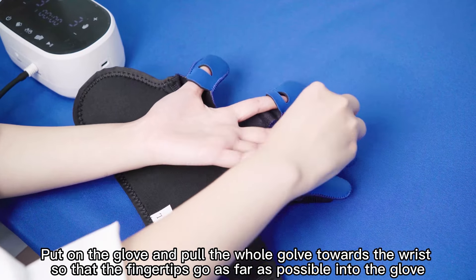To perform mirror training, insert the data glove plug into the data socket, and the power glove plug into the power socket on the side of the host. Wear the data glove on your healthy hand and the power glove on the affected hand. Select mirror mode and press the start button.